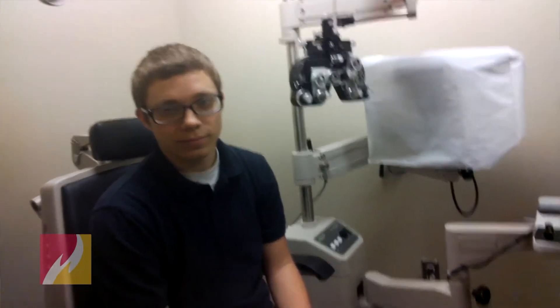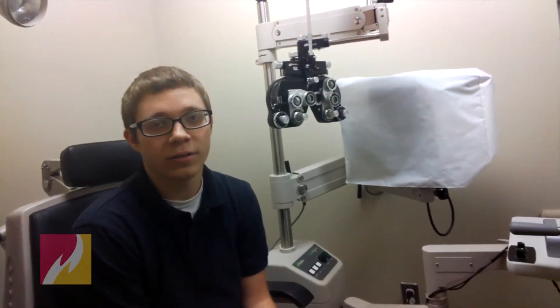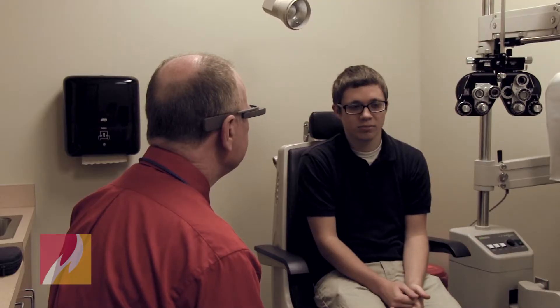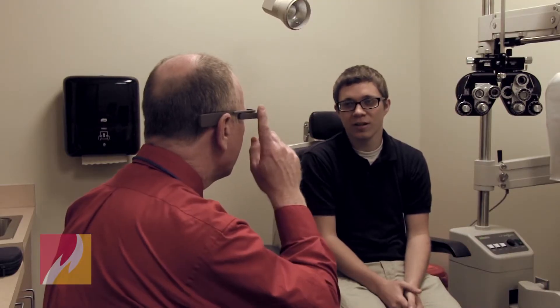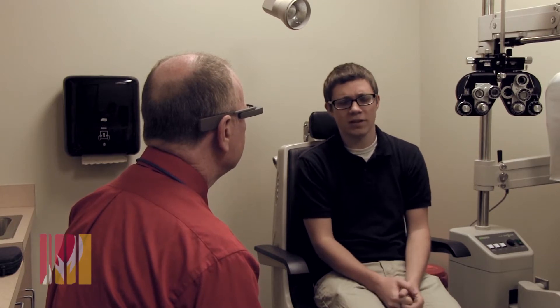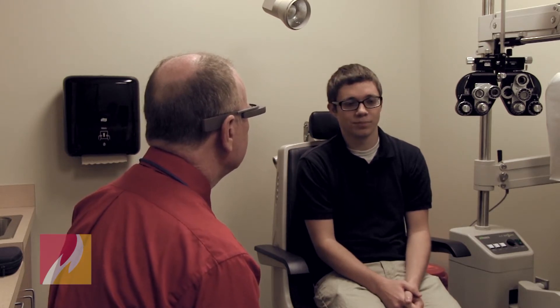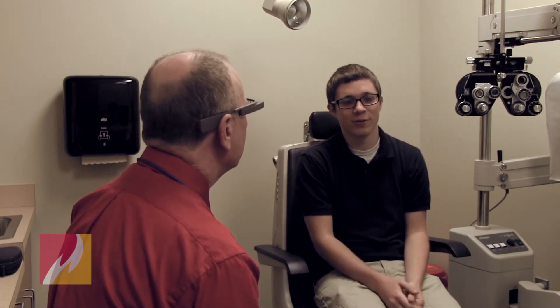Paul, can you tell me exactly what brought you in today? I've noticed recently that things at distance have started to get a little blurry. Well, how long has that been going on? Like three or four months ago I noticed it. And are you getting any headaches with that? Not that I've noticed. And what have you done to compensate for that? Just sitting in the front row of class, kind of eliminating distance for me.